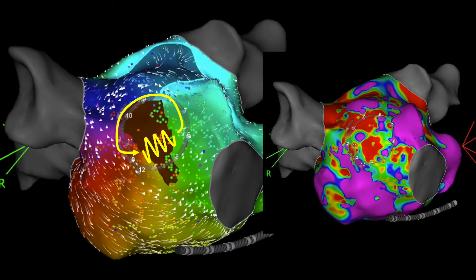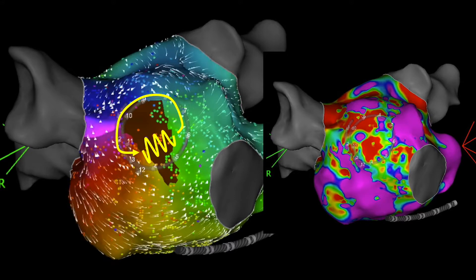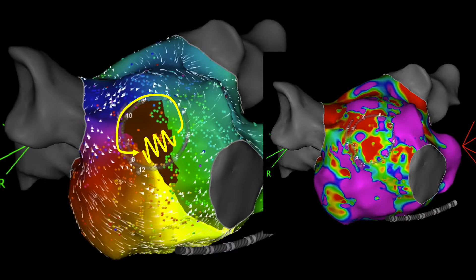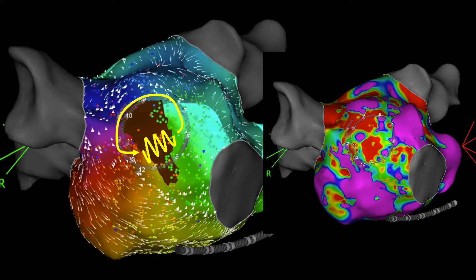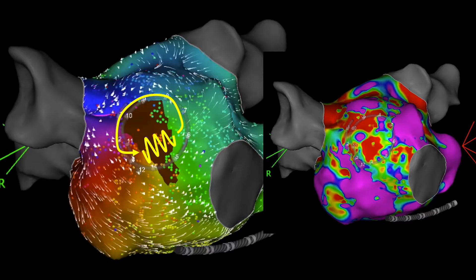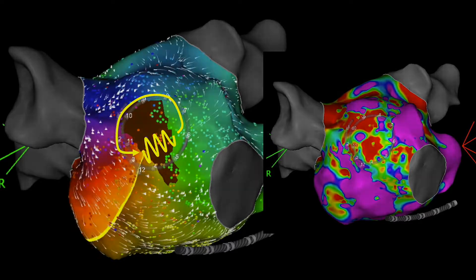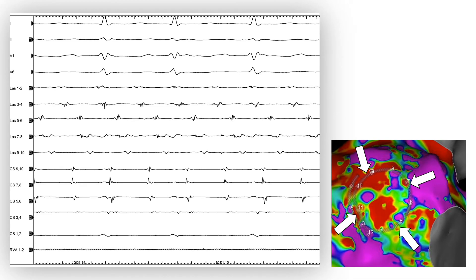Last but not least, review of the previous ablation procedure will help us understand the substrate that we would expect in the left atrium before ablating these tachycardias. In addition to coherent mapping, the focal potentials on the lasso catheter cover more than 70% of the tachycardia cycle length, confirming micro-reentry as the mechanism of the clinical tachycardia in this patient.